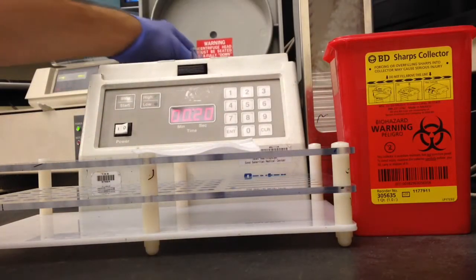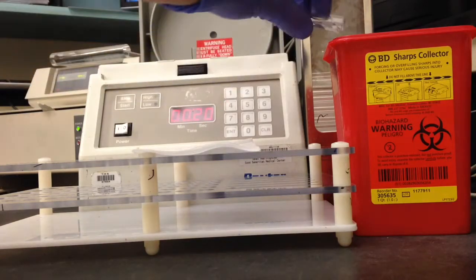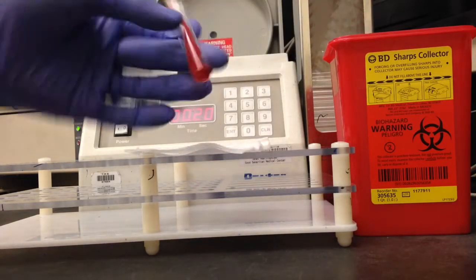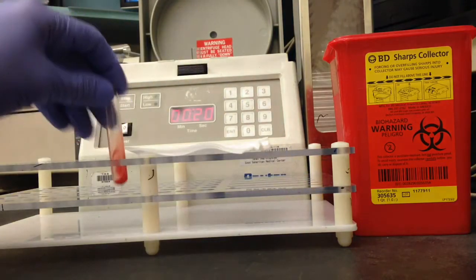And then after it's done you're just going to take it out and you're just going to decant it and pour off the excess saline and dab it on the 4x4 gauze just to get as much of the saline off as possible.